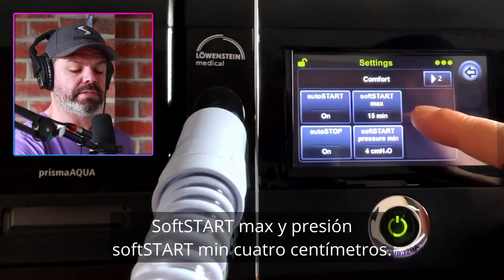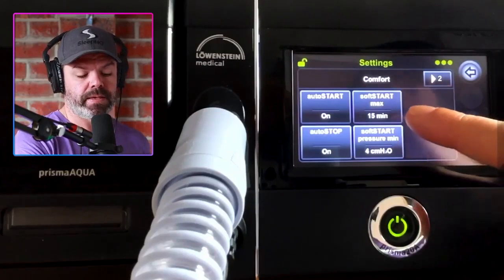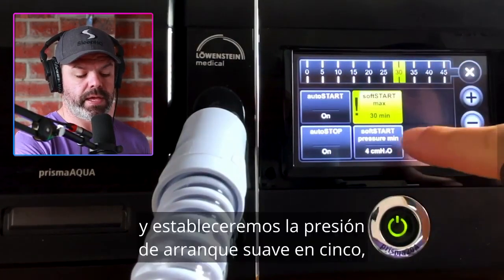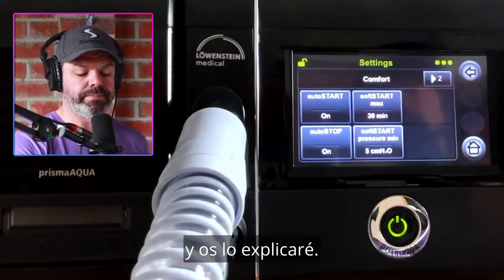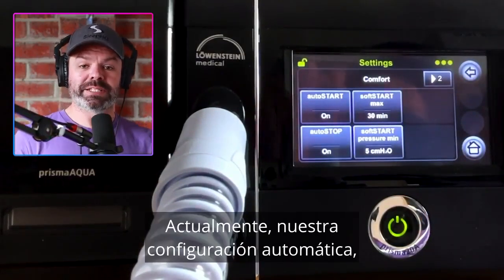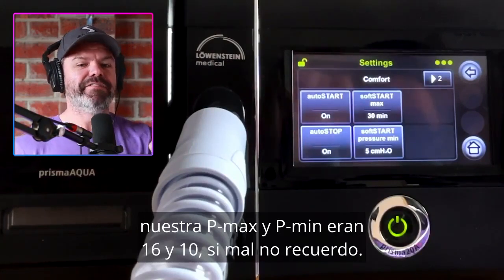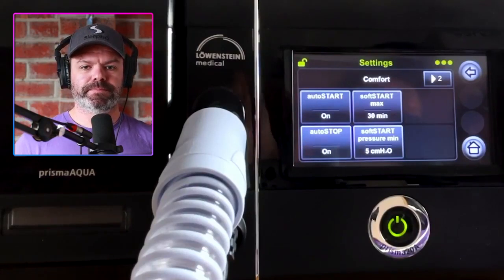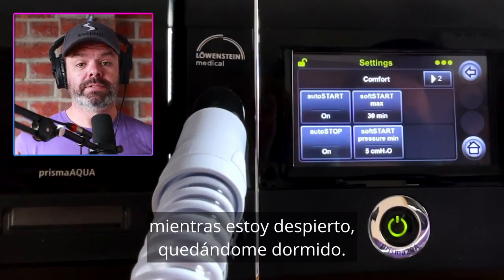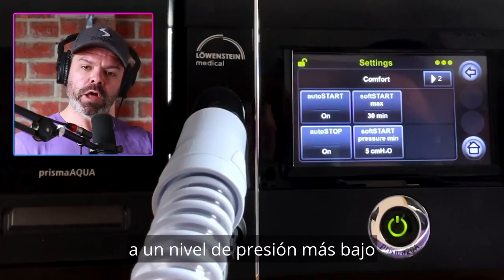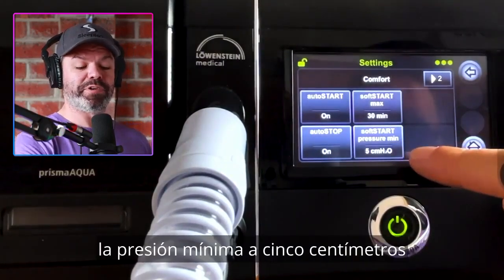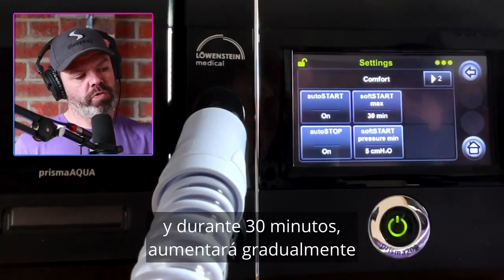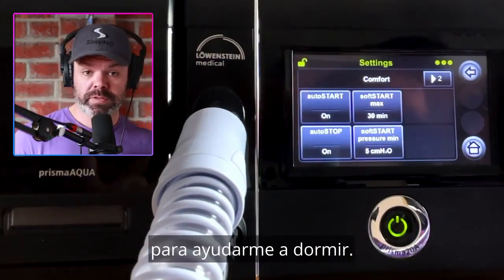Soft start max and soft start pressure min — this is like a ramp period. I'll just change soft start max to 30 minutes and set the soft start pressure to five centimeters. Our pressure min is 10, so 10 is the lowest level. You might find when you hop into bed that 10 is a little too high while you're awake and drifting off. So we set a ramp period at a lower pressure — starting at five centimeters and gradually increasing over 30 minutes up to the P min of 10, to help you get off to sleep.